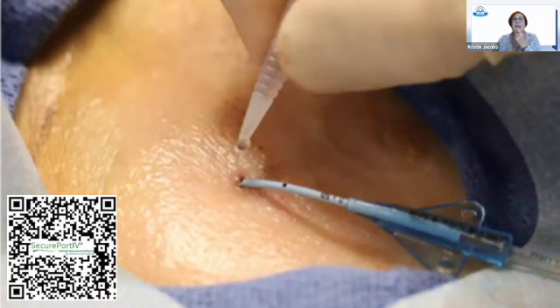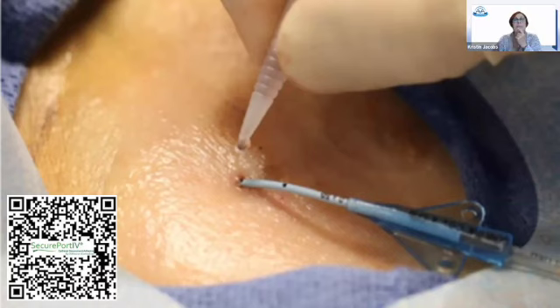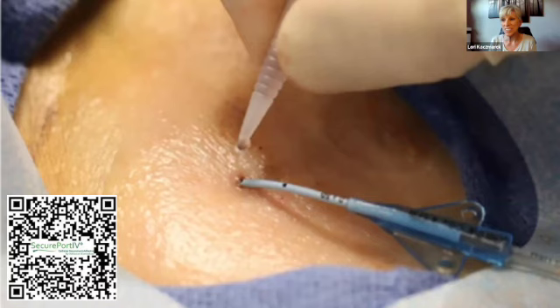Patty would like to know what topical thrombins are indicated for use on vascular insertion sites. We have lots at our disposal. You have StatSeal. Any of the products that you would normally use, the surgical thrombin products, can be used. Some people have a powder, some have disc form, but they rely on the presence of blood to be effective. So they are effective when you have that bleeding there, but this is an opportunity to stop the bleeding and stave it off right there. And I would check with materials management in your hospital too, because there are so many different contracts.